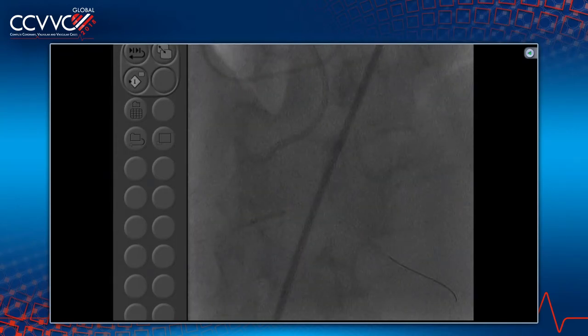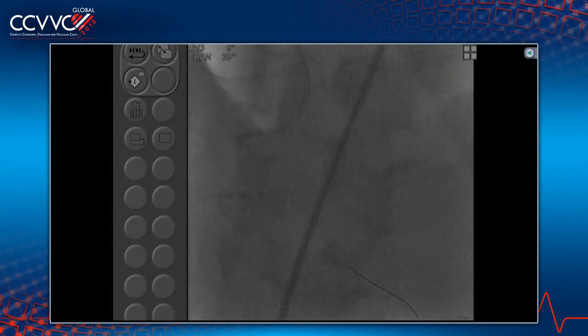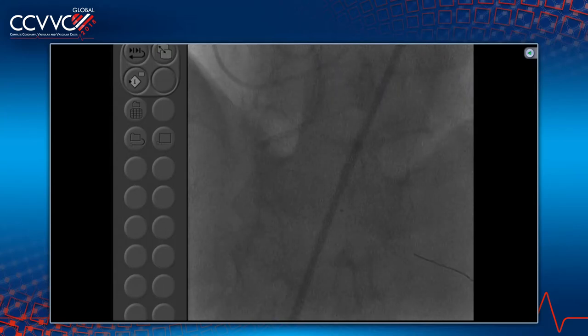That's good. Just inflate here. Every time it goes a little bit further, so it's a good sign. Well, if you need 5 or 6 inflations, so be it. So, Sunil, so far, what has the radial approach given us? What could it have given us that we don't have here? Or are we in a situation where the support was superior to a radial for this case? We really haven't used a contralateral injection anyhow.